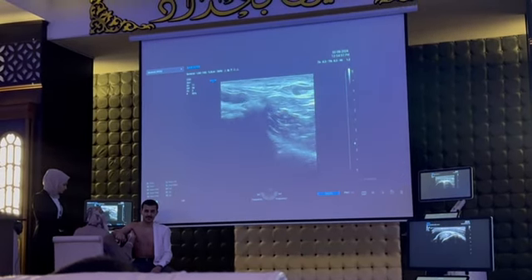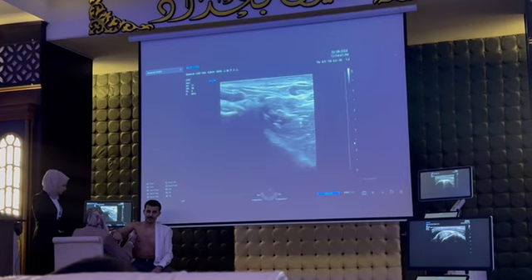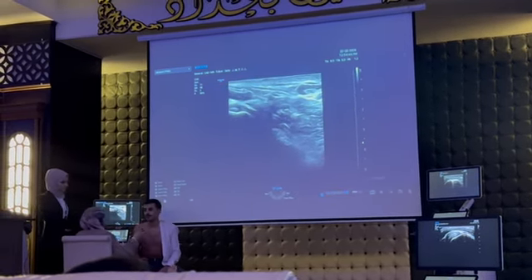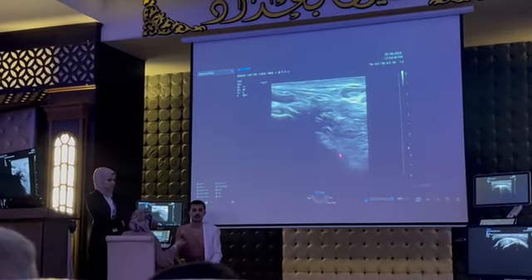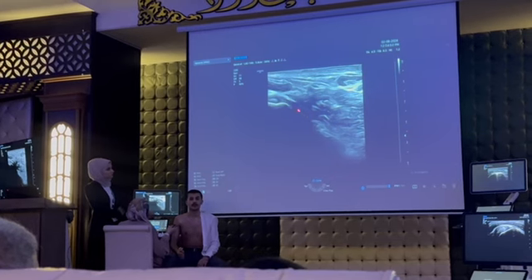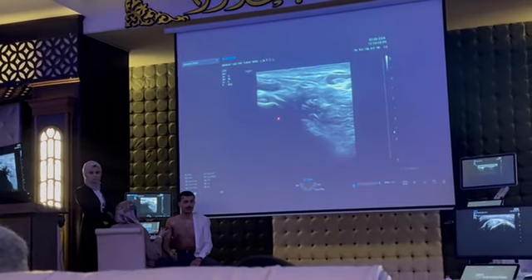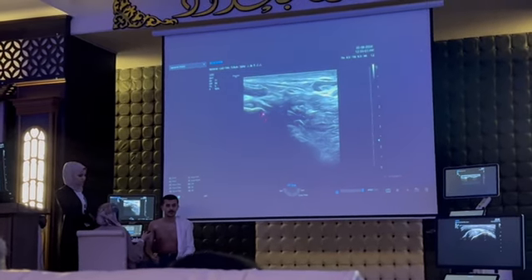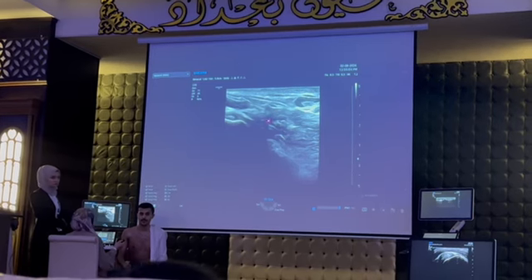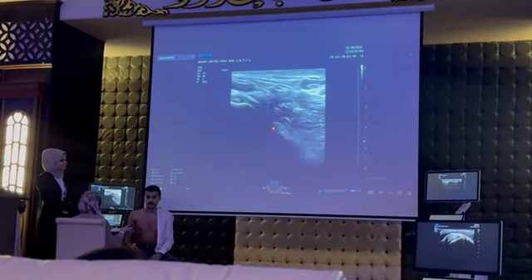The white line between them, because I should press. This white line between them is the inferior glenohumeral ligament. We should press because the axilla is a deep fold, so we should press more for examination of this ligament. This is part of a frozen shoulder, together with subscapularis muscle impingement and the coracohumeral ligament.